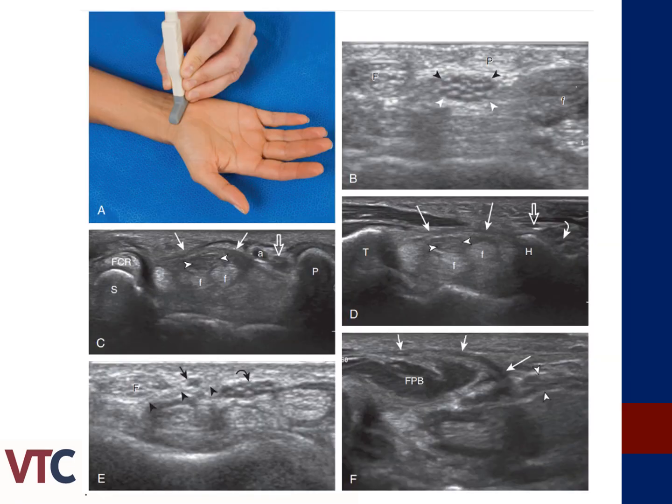The next couple slides will be looking at different ultrasound imaging of the carpal tunnel as it progresses in a proximal to distal fashion. So you'll see here in this top right corner with the closed arrows, what it is encircling here is our median nerve, which is of interest. One of the most common sites to be measuring for carpal tunnel syndrome is at the level of the carpal tunnel inlet or the pisiform. So you'll see the scaphoid here and the pisiform located there. Again, the median nerve is between these two arrows.